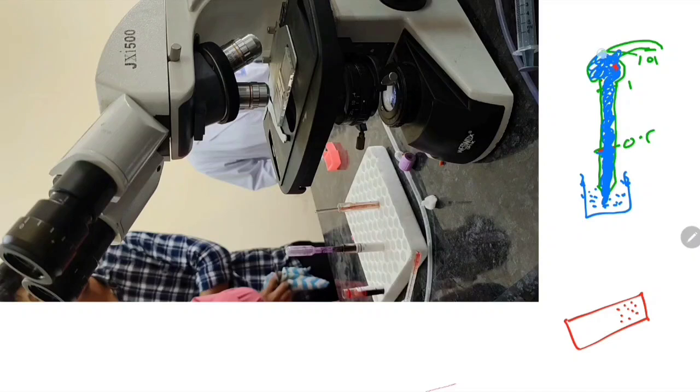So this bulb part will contain 0.5 blood, and the rest diluting fluid. And this part up to one will contain only diluting fluid.